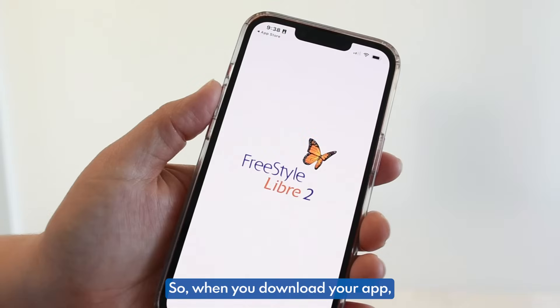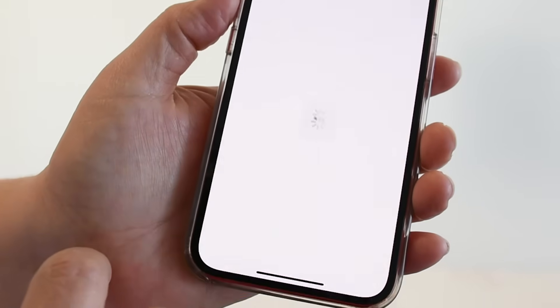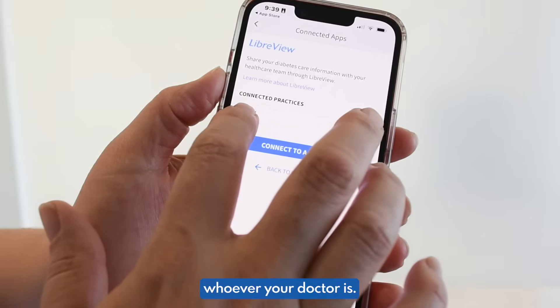When you download your app, you're going to open it. You're going to go to the three lines at the top and go to Connected Apps. You're going to connect to LibreView right here, and then connect to your practice — whoever your doctor is.